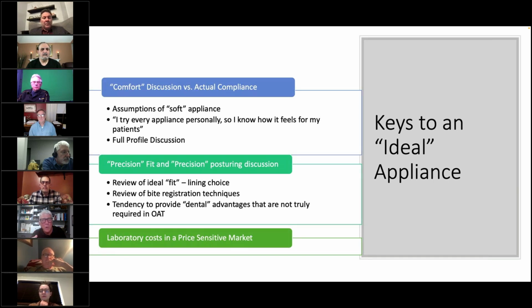And that much of the work has demonstrated that oftentimes we even start too far out and that we can do better at lower levels of protrusion and going slowly. So comfort is obviously critical. And going too far out initially can be emotionally not in our best interest.